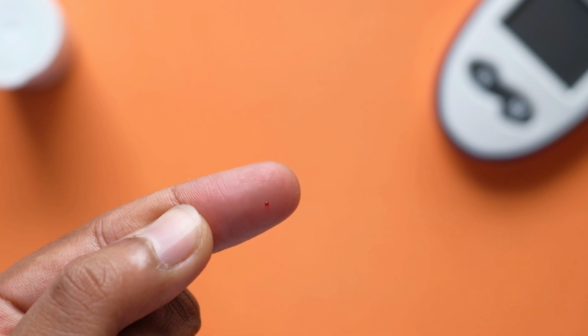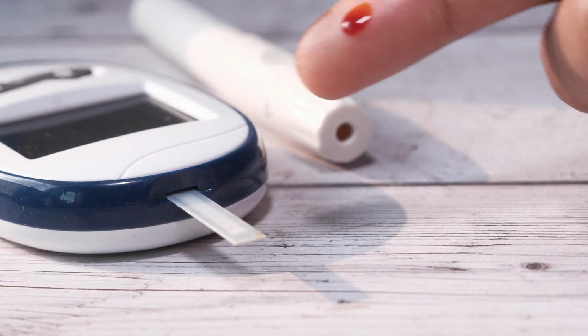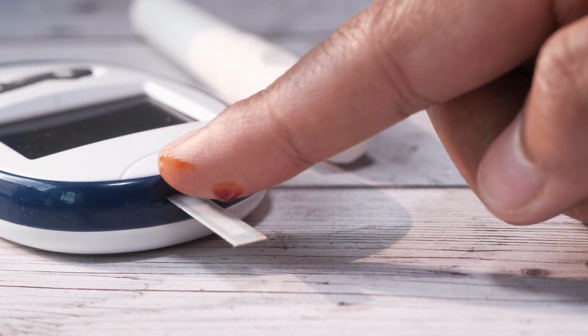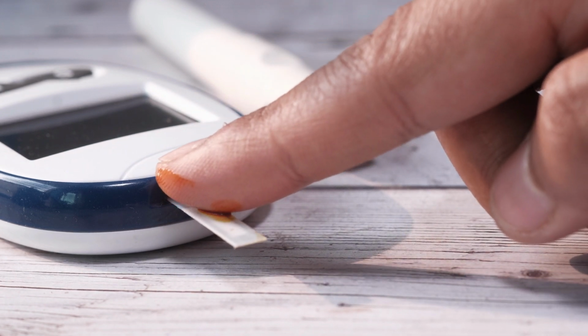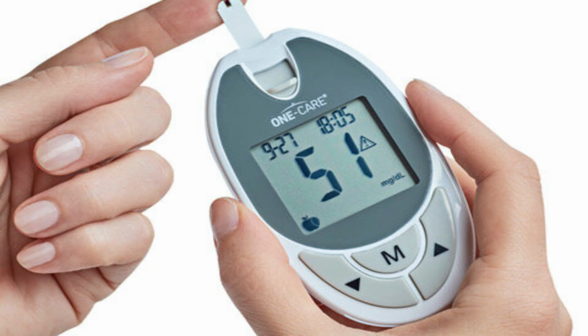Finger prick test can be a hassle for many as it's painful, you need to use needles, and it's basically a process. You need to take out the lancet, find a quiet place, prick your finger, put the blood on a test strip, then make sure the glucose meter is working.